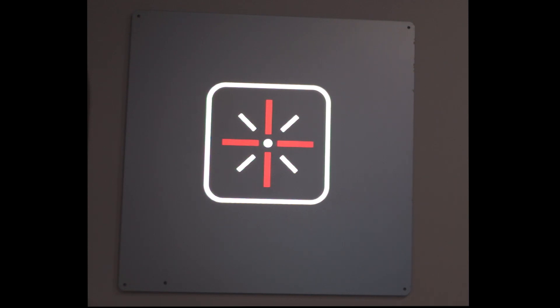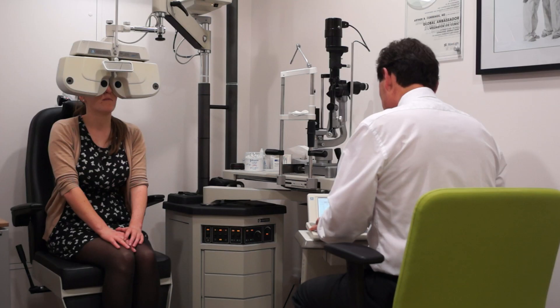If you have one eye that's heavily suppressed, you'll only see the 3 o'clock or you'll only see the one at the 6. Let's have a look at this.